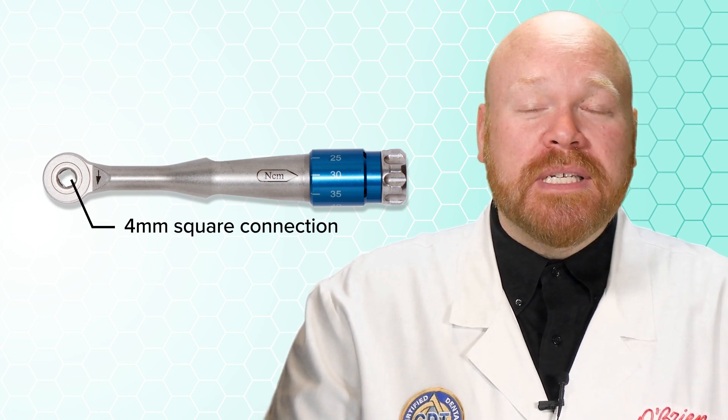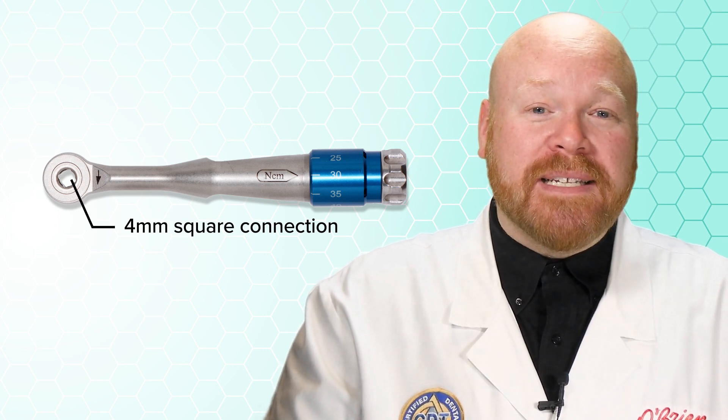Hey everyone, Alex from O'Brien here. At the end of my last video on torque driver compatibility, I mentioned the adjustable torque wrenches that have the 4mm square connection. Those are great universal wrenches that can be used for every implant system.